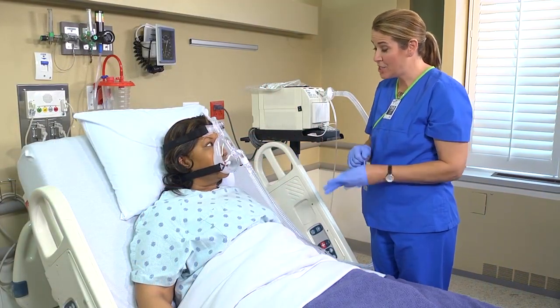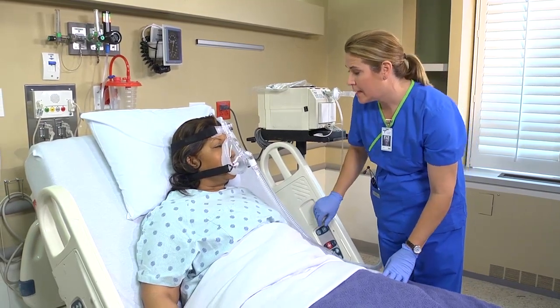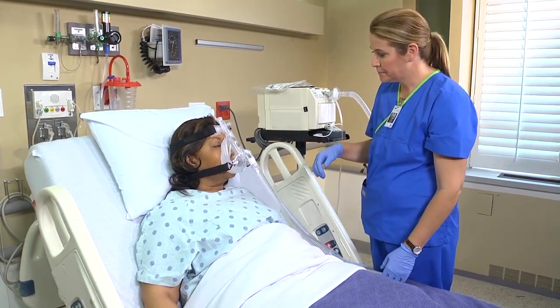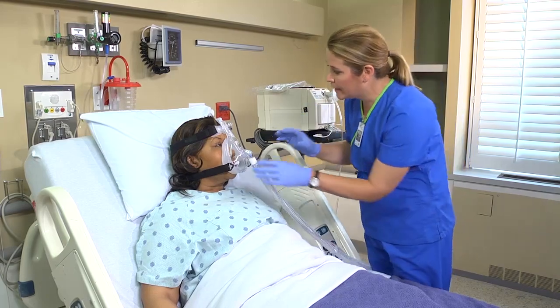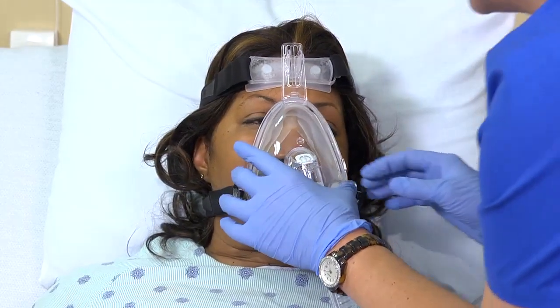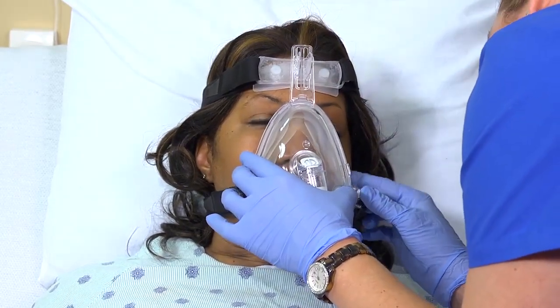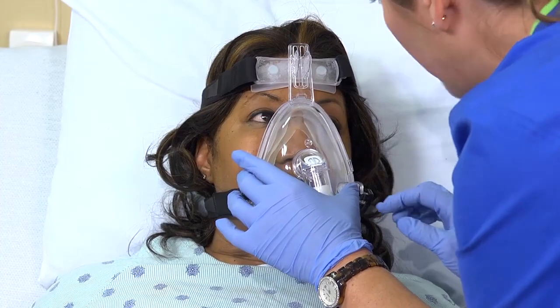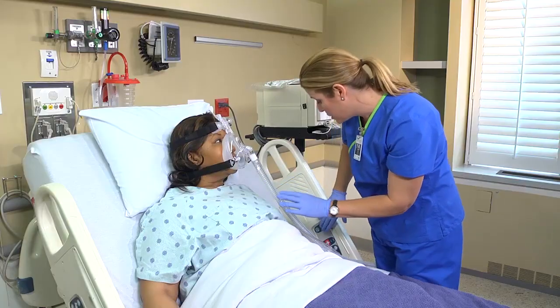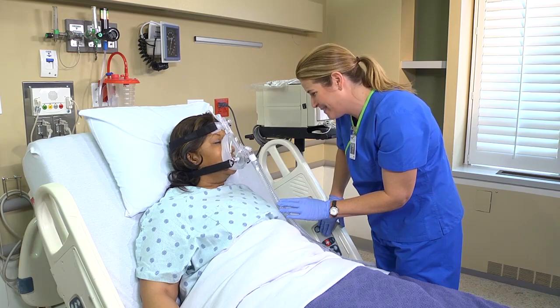Ms. Simmons, I'm back to check on your breathing. Are you breathing more comfortably? Is the mask comfortable? Are you experiencing any areas of pressure where it's hurting? Assess the patient's skin frequently to look for signs of pressure, irritation, and breakdown. There's no areas of redness. If you have any problems, your call light's right here, so just let us know if you need anything.